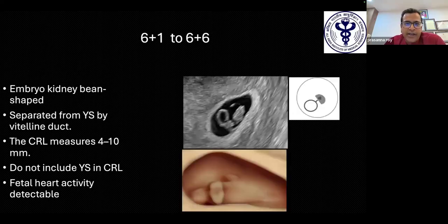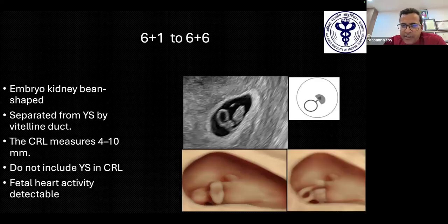We have to use higher end techniques like 3D and use HD Live and Silhouette applications to actually make out the development of the embryo or the fetus, because it can be used to study the normal development of the embryo or the fetus, or we can identify congenital abnormalities also at below 10 weeks of gestation. No matter how much the genetics and the sequencing techniques improve, fetal ultrasound is the only technology which has direct observation of fetal structures and function from the early gestational age.